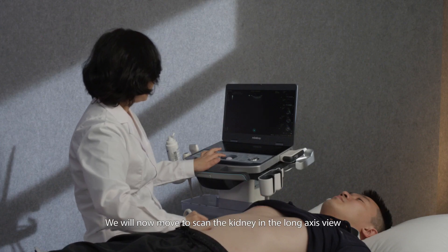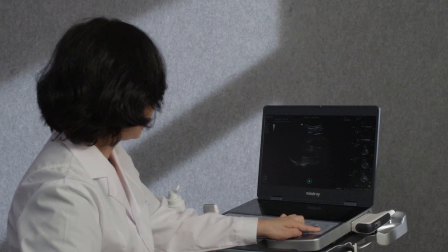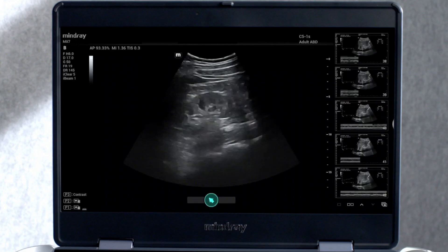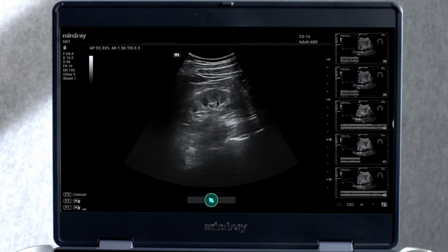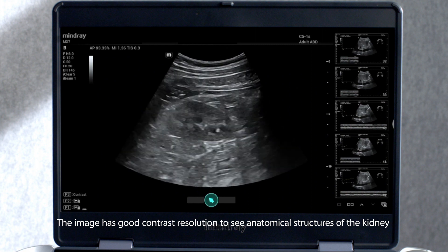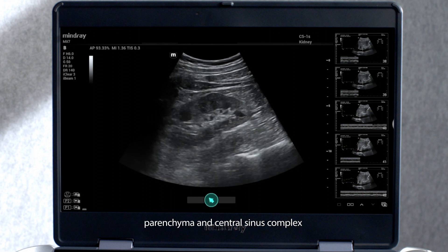We will now move to scan the kidney in the long axis view. The image has good contrast resolution to see anatomical structures of the kidney, such as the renal capsule, parenchyma and central sinus complex.